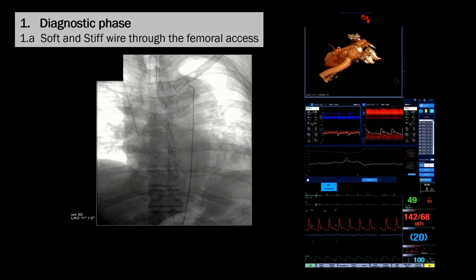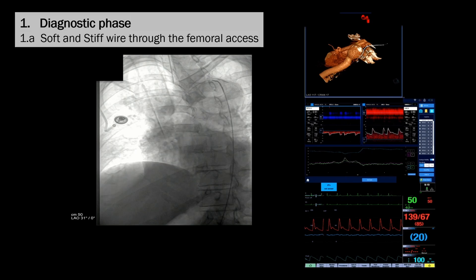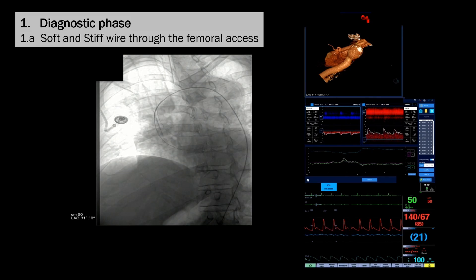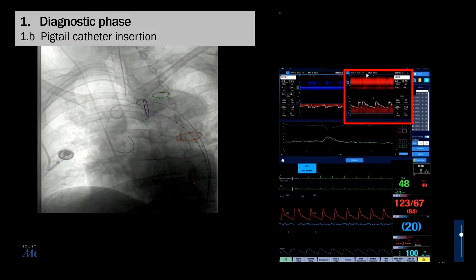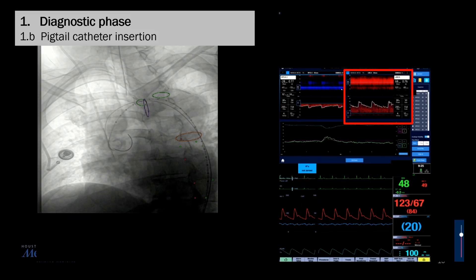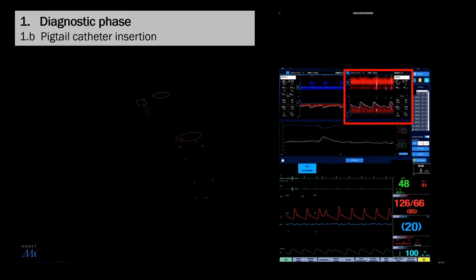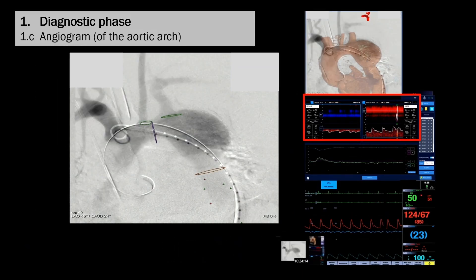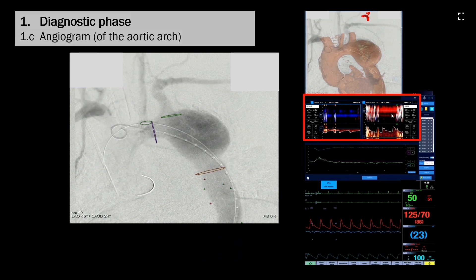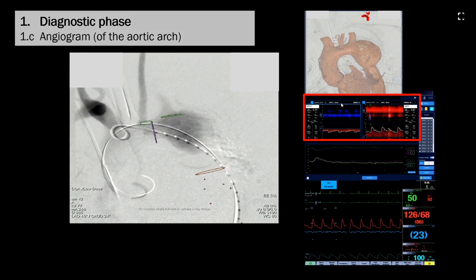A soft glide wire is being introduced into the ascending arch through the burn catheter and exchanged for a curved Lunderquist wire. No hits were seen on the TCD screen during this phase. The next step is delivering the pigtail catheter — take a look at the TCD screen as some hits will be seen in the left middle cerebral artery. The first angiogram delineating the arch anatomy caused multiple hits bilaterally, seen in the left middle cerebral artery and the right posterior cerebral artery.